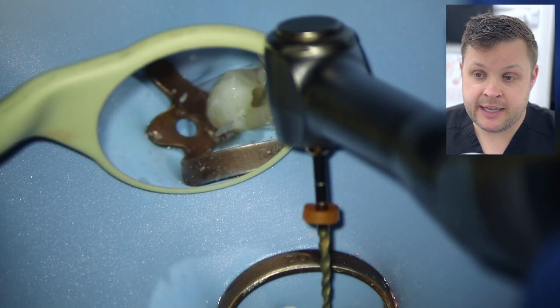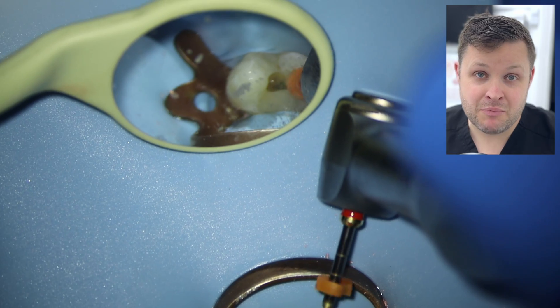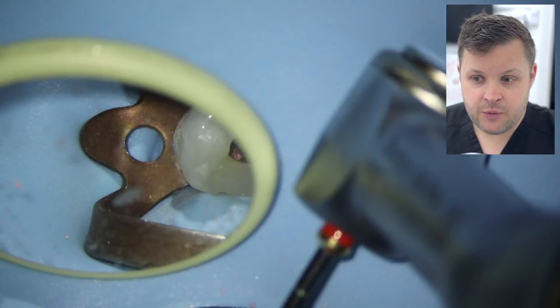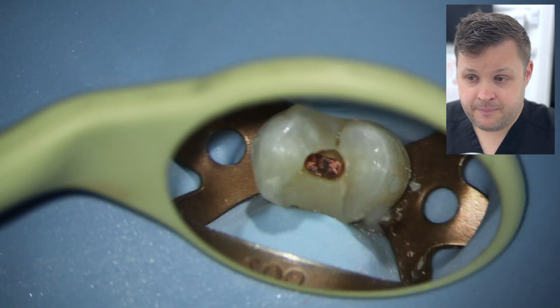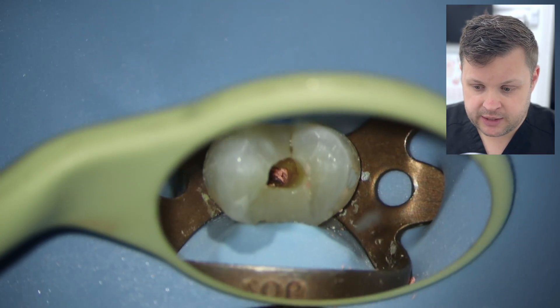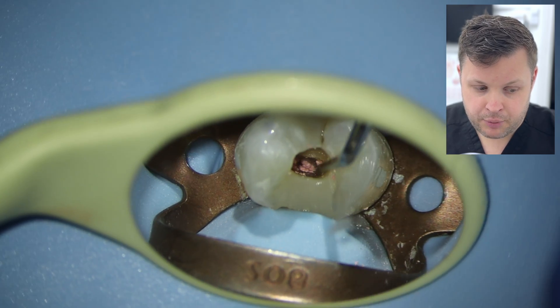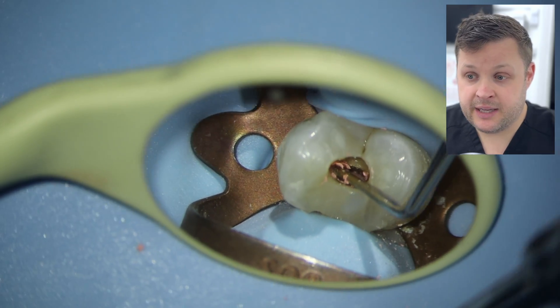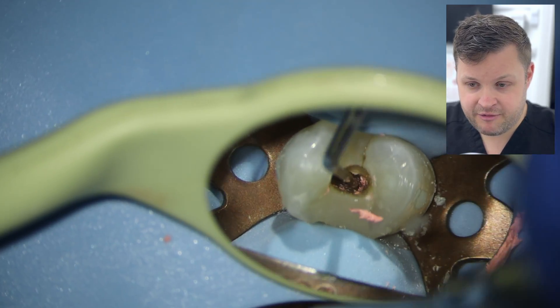I don't often use rotary files straight away to remove GP because if it's all the way to length, rotary files can push the GP past the working length. The problem with H-files is they take forever. In this case extrusion isn't a massive issue since it's short of working length, so I used the rotary. However, I've mushed up a lot of the GP — a problem with rotary files is they can break apart the GP and create tiny fragments that are difficult to remove.